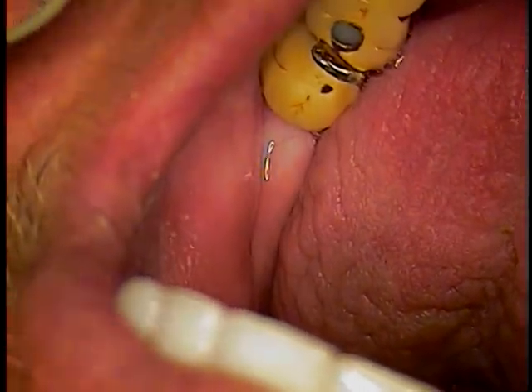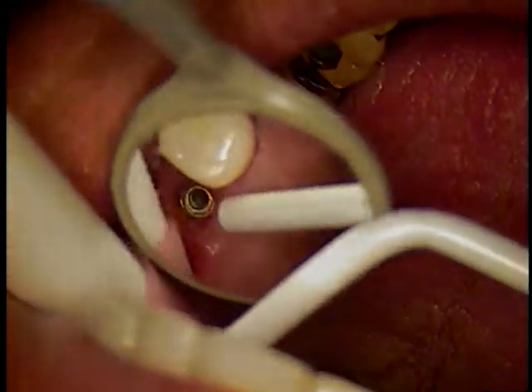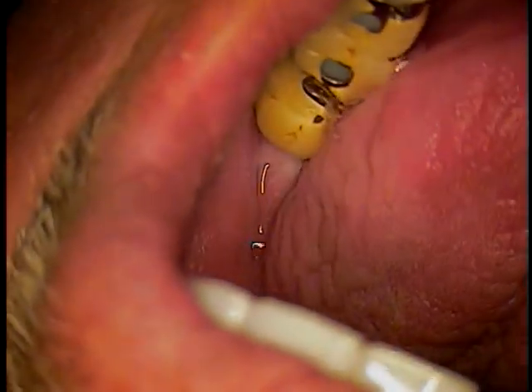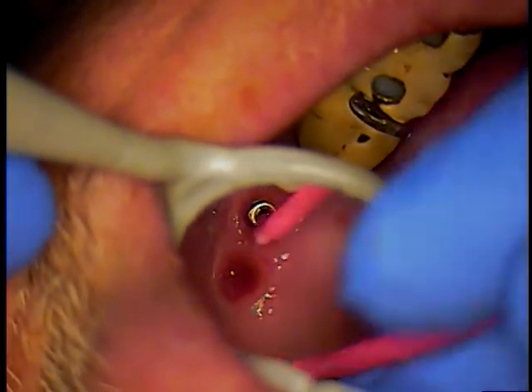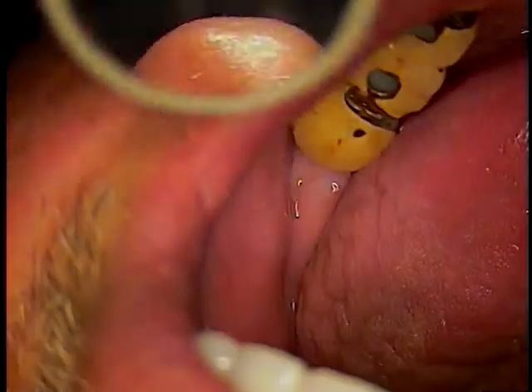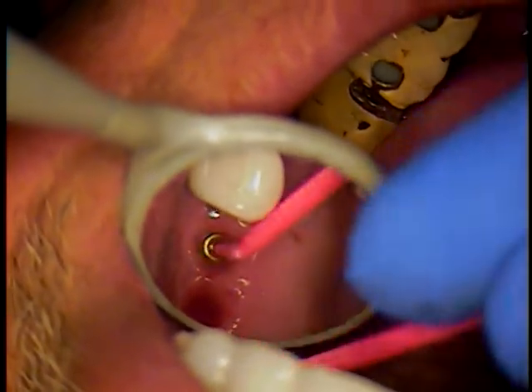And that one is A-OK. Rinse. So what I'm going to do is take the better of the two. Let's clean the threads on this one. Here we go. Because you have a broken prosthetic screw in it, I can't use the top portion. The top portion's fine, there's nothing fractured, but the implant fixture on the second one is not good. I'm going to just clean these threads and get them all pristine. No, the yellow's fine.